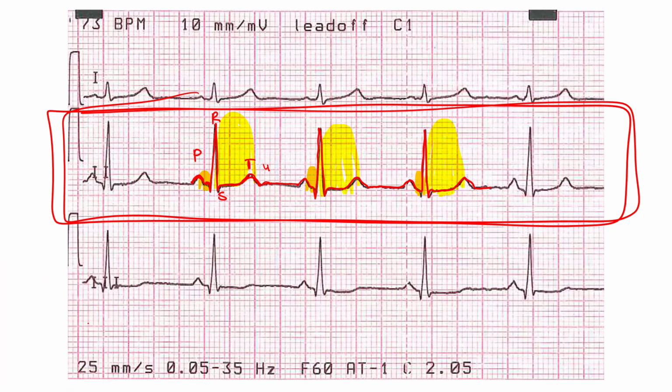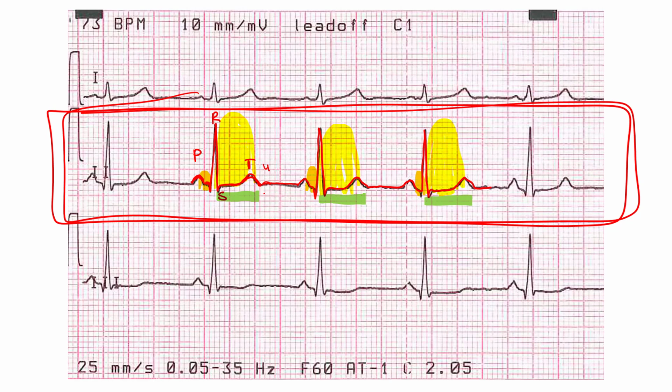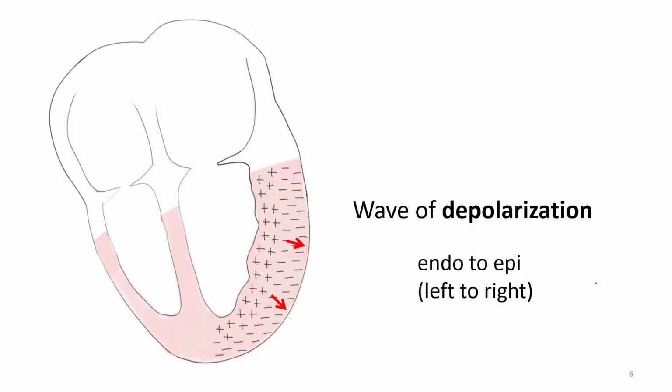If you wanted to see where diastole would be, well, first we'll shade in systole. If you wanted to see diastole, relaxation and filling of the heart, that would be between the T wave and the next cycle beginning, in the case of the ventricle, the QRS. So that would be ventricular diastole, when filling of the heart occurs. So again, we can't see that on the ECG. We can only infer where those would happen over time.